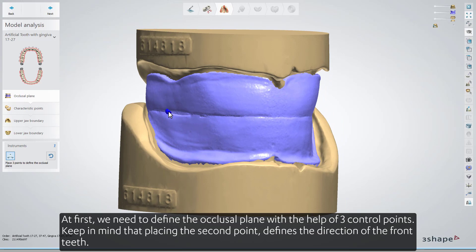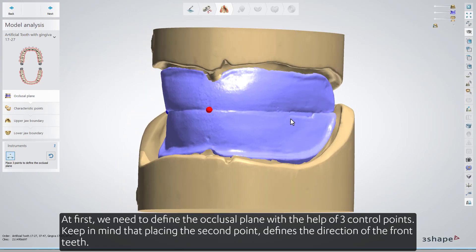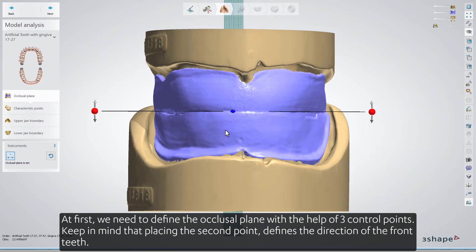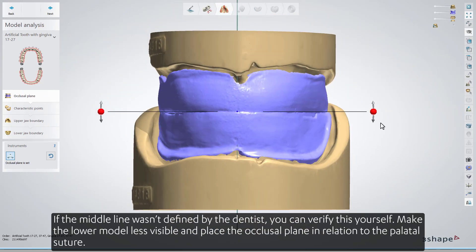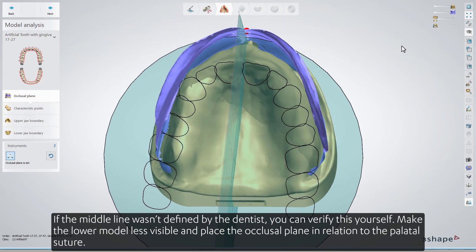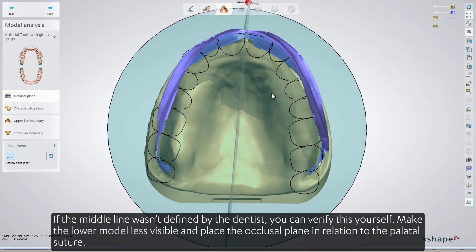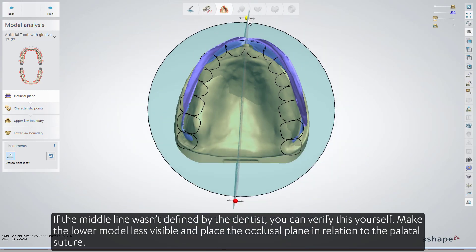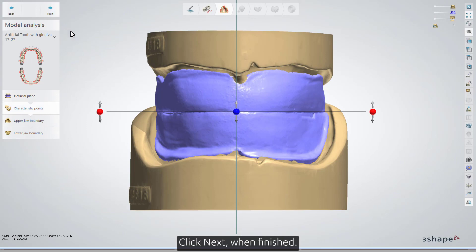At first, we need to define the occlusal plane with the help of three control points. Keep in mind that placing the second point defines the direction of the front teeth. If the middle line wasn't defined by the dentist, you can verify this yourself. Make the lower model less visible, and place the occlusal plane in relation to the palatal suture. Click Next when finished.